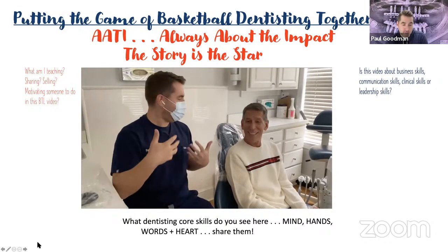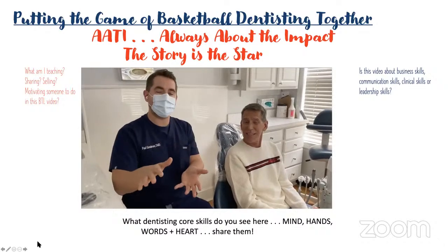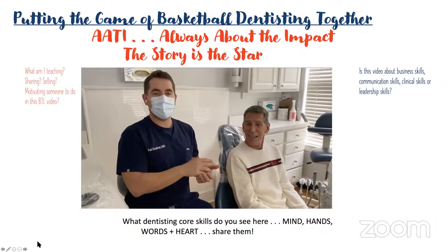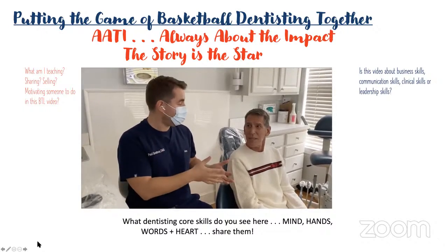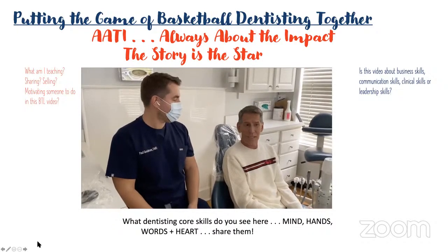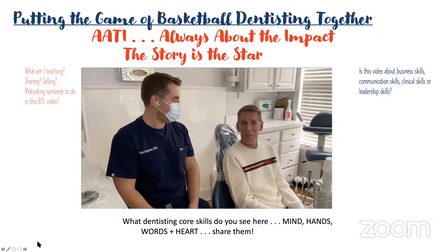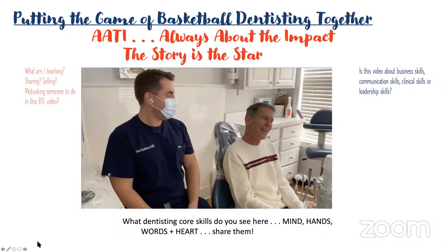Rick, an extra set of teeth. I don't have an extra set of teeth. Yeah. So if anything ever happens, always be planning ahead, dentist. If a tooth needs to be repaired, if acrylic fractures off, if there's a challenge, you have a whole extra set, which you made at that time. Does that make you feel more confident and secure? Oh, without a doubt, except I forget that they're not mine. I don't even think, oh yeah, there's an extra set. Yeah, but it is good when you point out that I do have one.